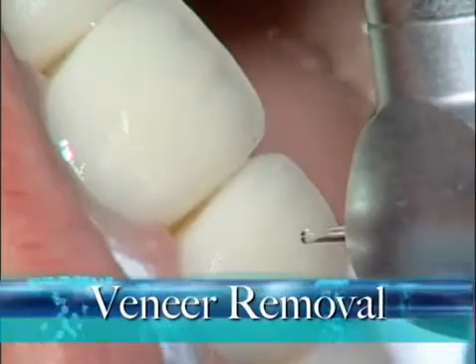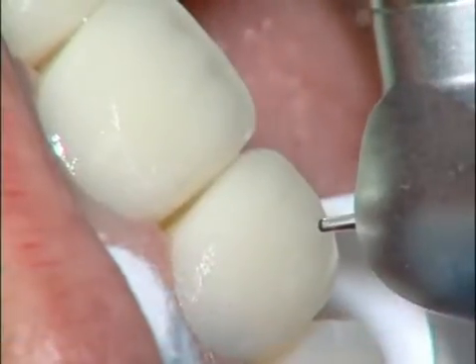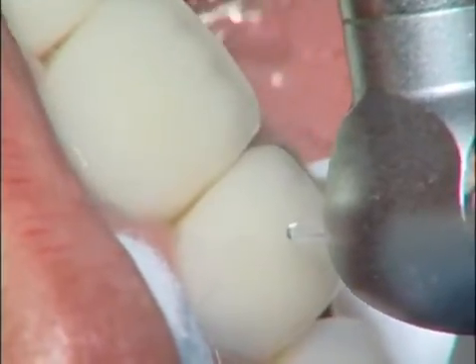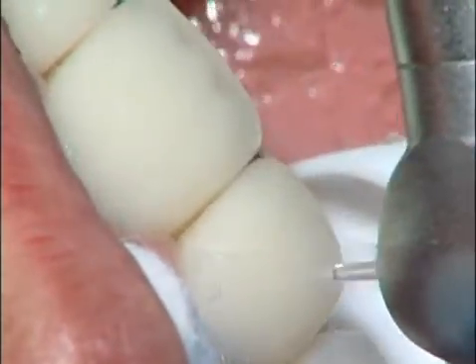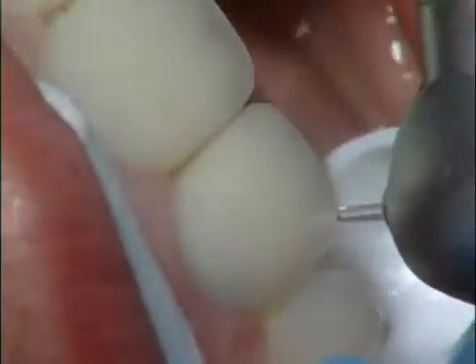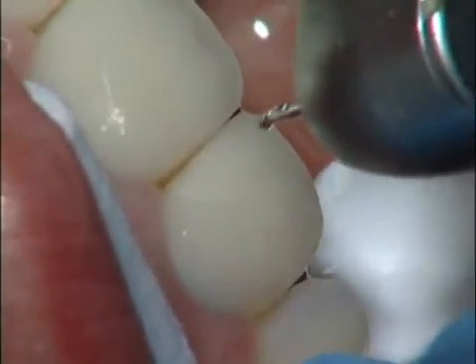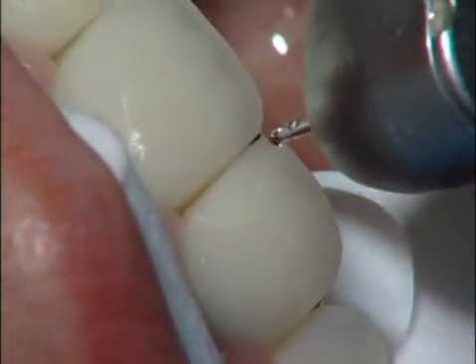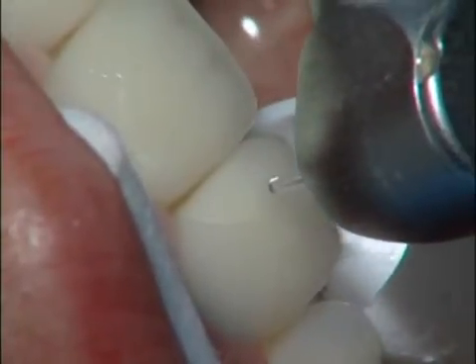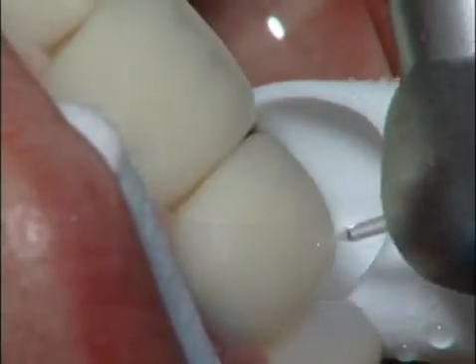One of the nice features of the Waterlase is to be able to remove veneers. And we have to remove veneers occasionally. These have to come off because of microleakage. Sometimes they have to be removed because they've chipped and you have to redo them. And they can be difficult to remove. If you try to remove a veneer with a high-speed diamond, it can overheat the tooth and cause irreversible pulpitis.